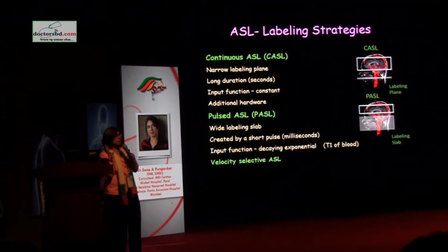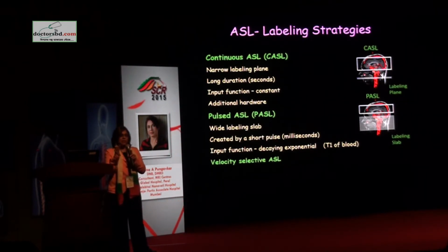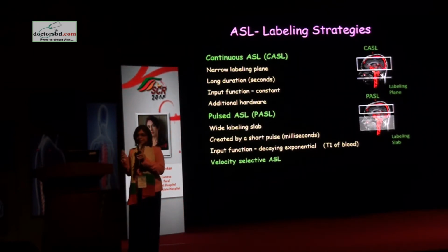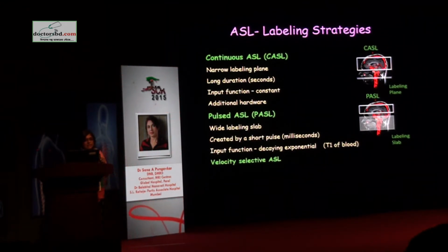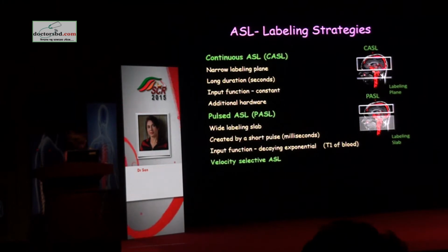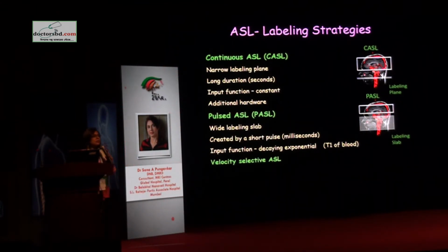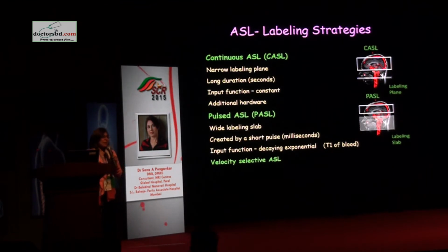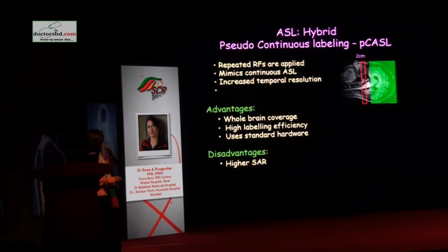You will be able to separate out the blood flow between right side and left side, plus each artery individually, say external and internal carotid arteries, and that is very exciting because you can actually avoid a lot of invasive procedures. I know some neurointervention people here will not be happy when I say that, but you can avoid some of the invasive investigations.